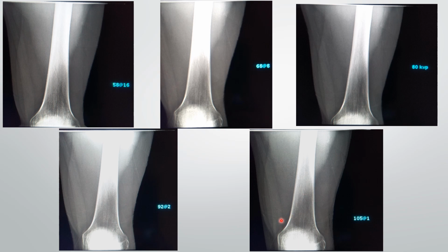The total brightness of the images, which would be the total IR exposure, is about the same in all these images. It just depends on the anatomy that's being visualized, right? So this is an example of the 15% rule at work.